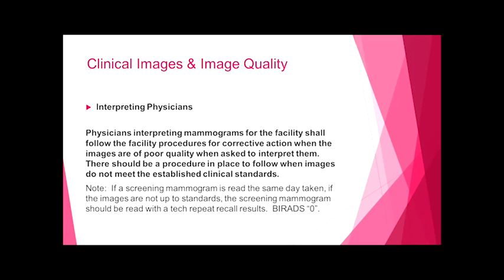So if a screening mammogram is read the same day it's taken, and the images are not up to standards, then that screening mammogram should be read with a tech repeat recall result and a BI-RADS 0.